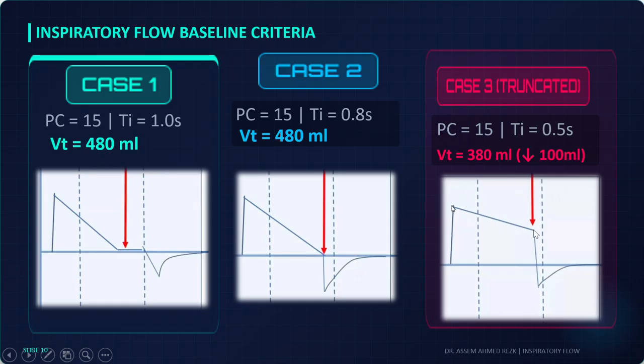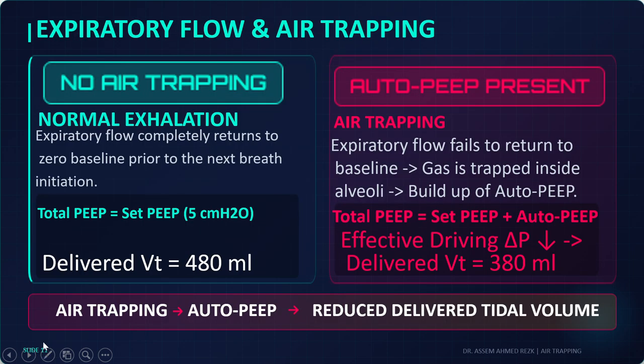In this case, you didn't reach the baseline. In this time, the patient needs more inspiration. So the tidal volume decreased by 100 ml and you start your expiratory phase.